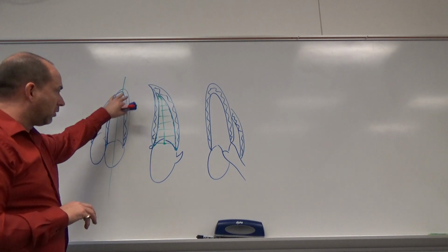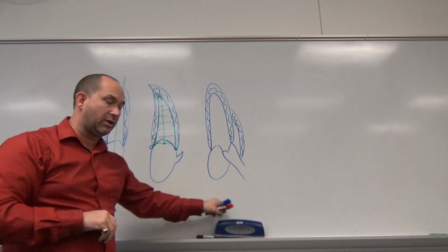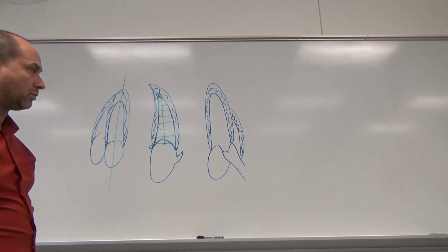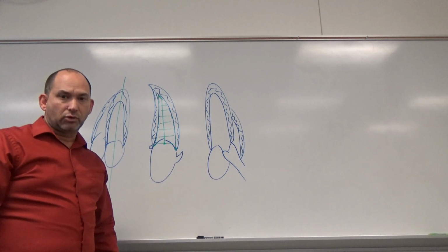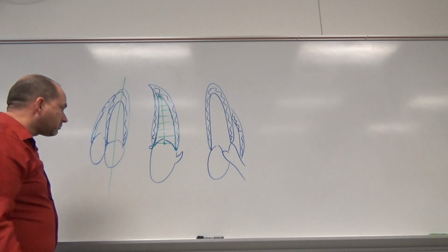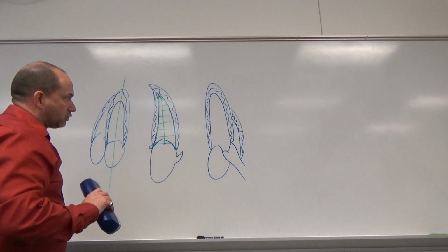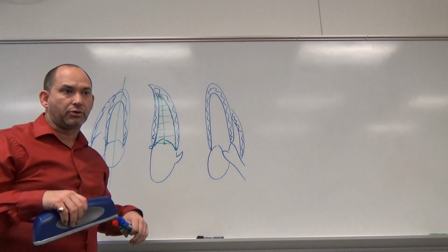Later on, we're going to talk about wall segments and how to evaluate those walls and how important those are to us, particularly for coronary artery supply. This view, incidentally, is exactly the same view as your parasternal long axis, but we're seeing it now from the apical perspective rather than from anteriorly. Trying to think if I forgot anything else. That should, in essence, be the basic echocardiogram.